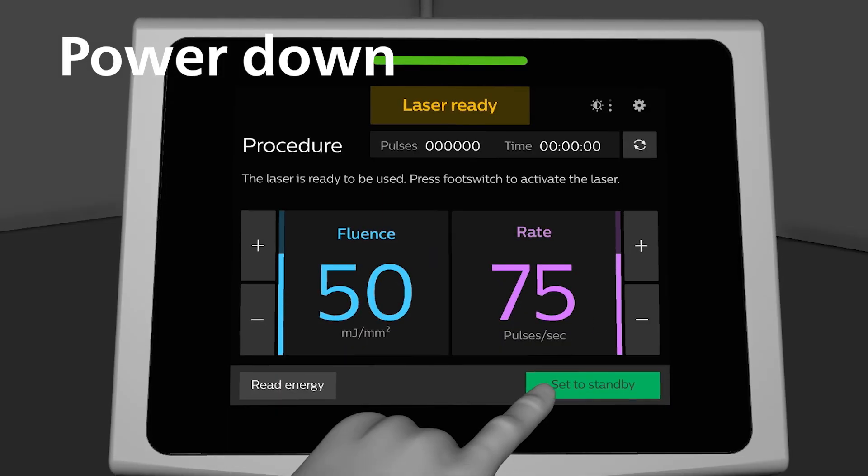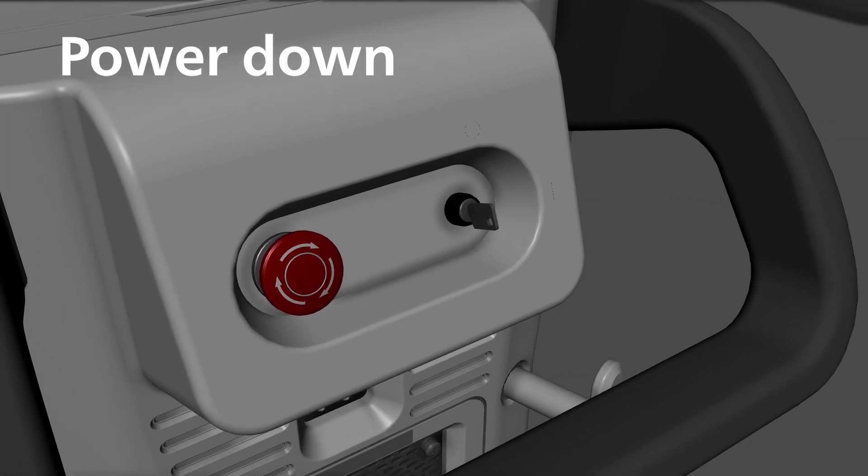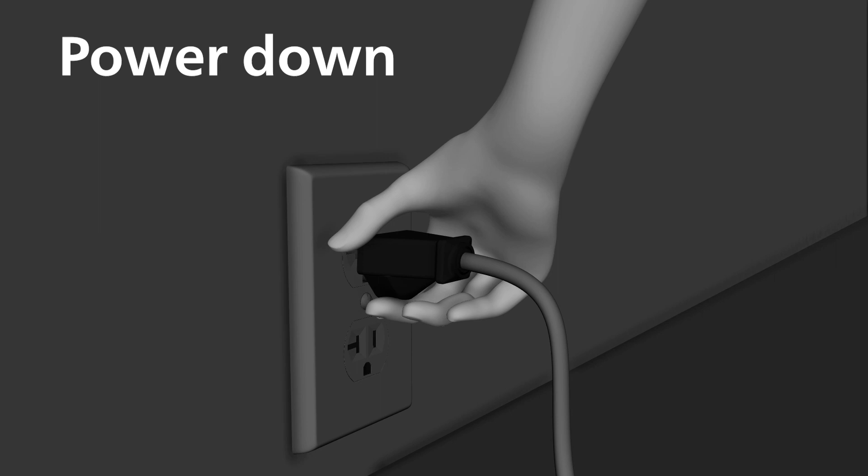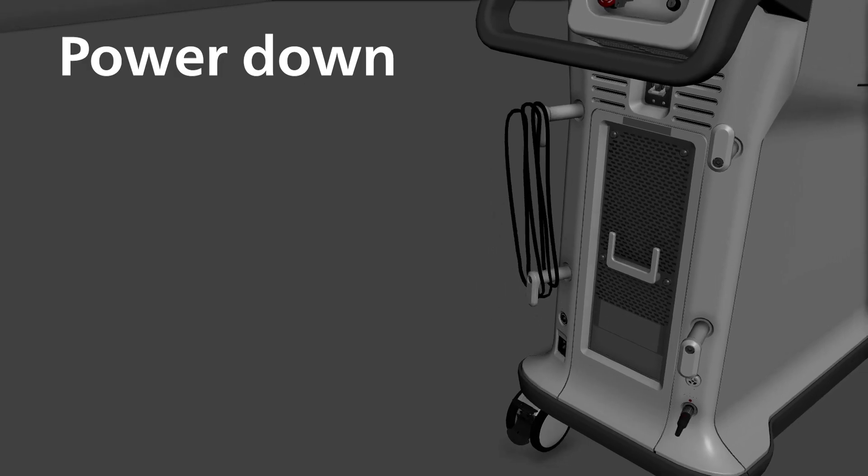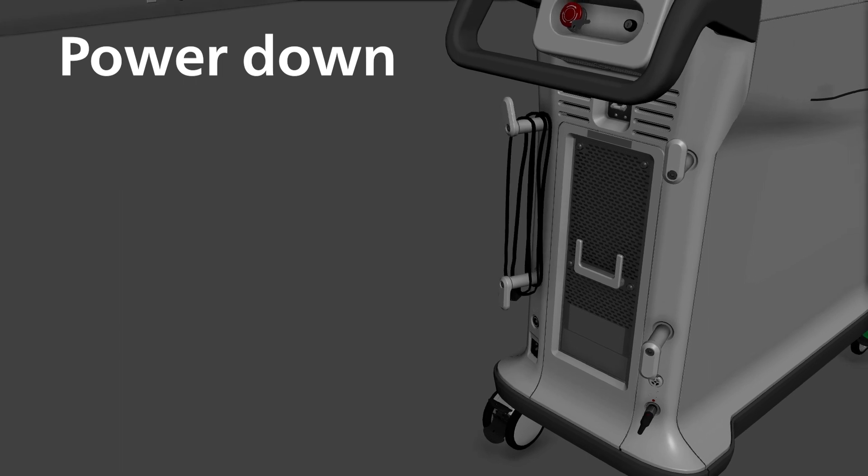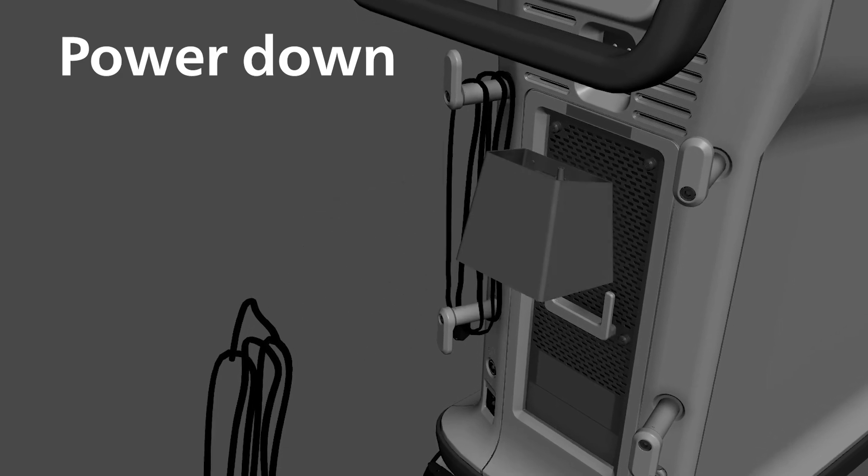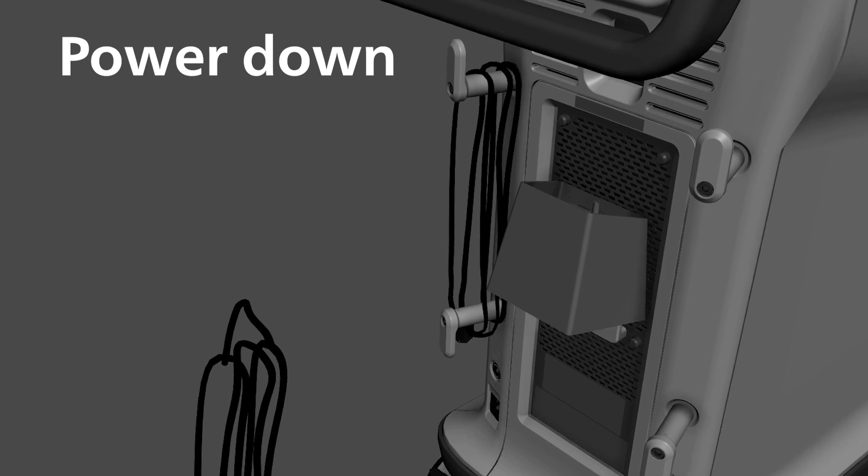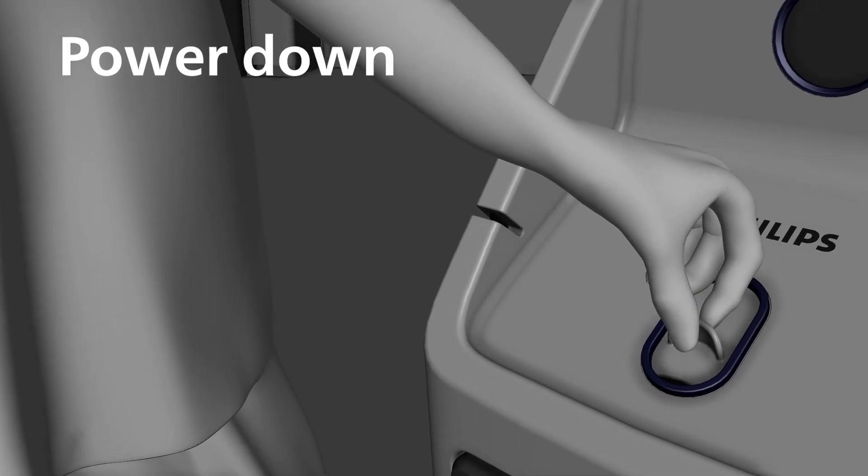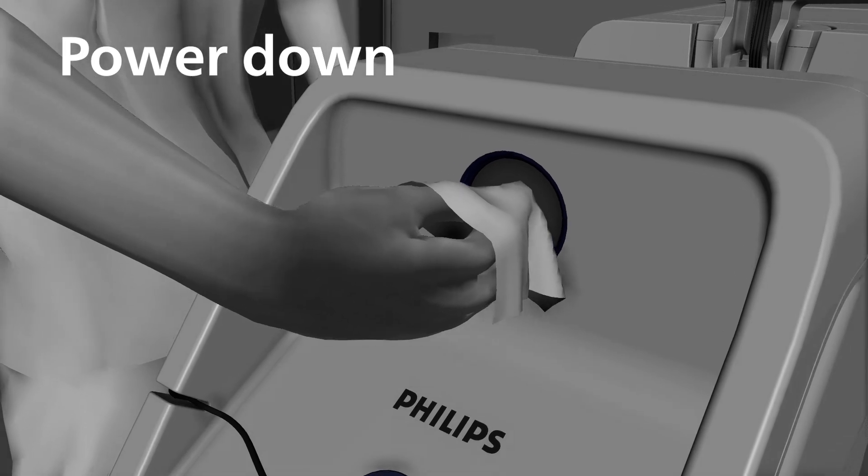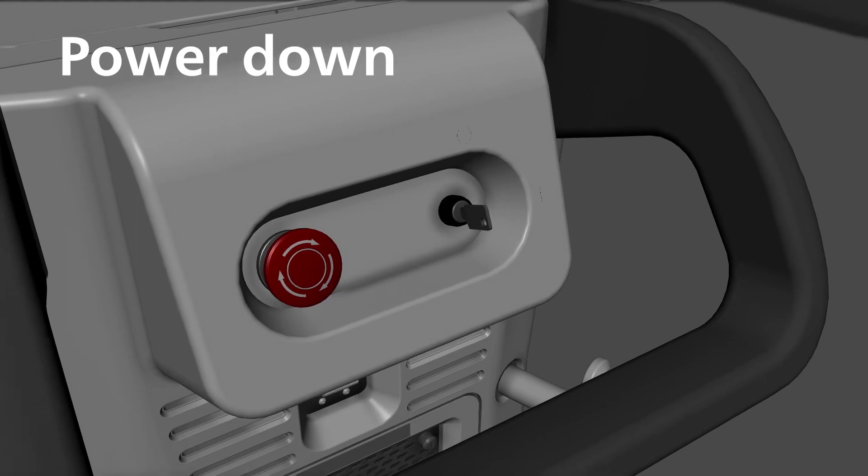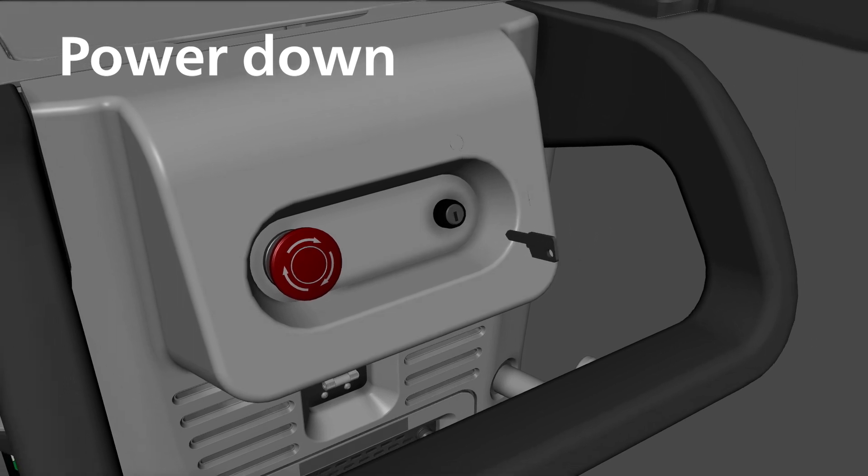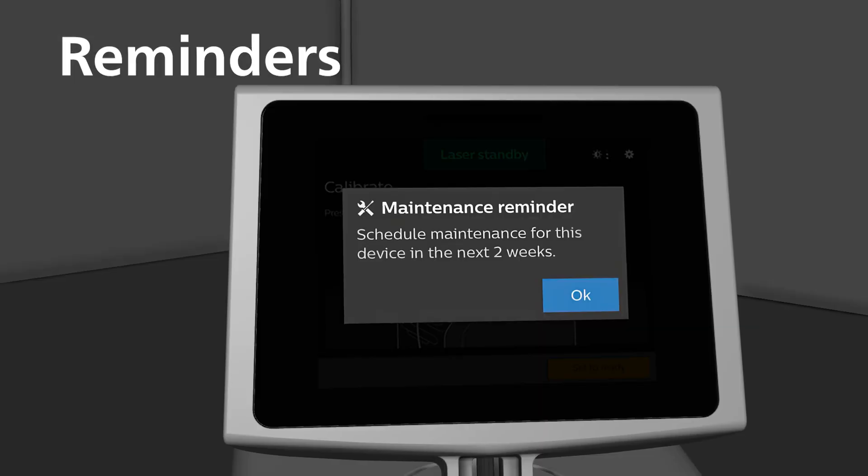To power down the system, press the standby button and turn the key switch to the off position. Disconnect the power cord from the wall receptacle and store it on the cable management wraps at the rear of the system. Then disconnect and store the foot switch at the rear of the system. Close the catheter connector door and clean the detector face with alcohol prep. When not in use, remove the key to protect the system from unauthorized use. Return the system to your storage location and lock the rear wheels.